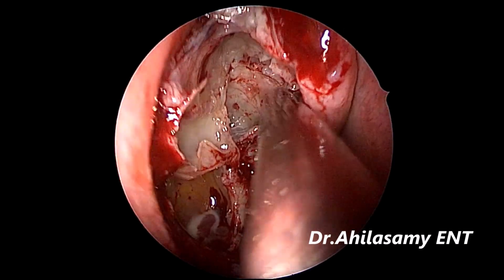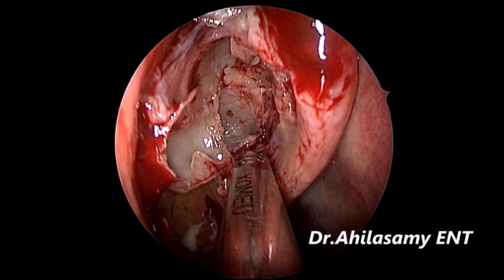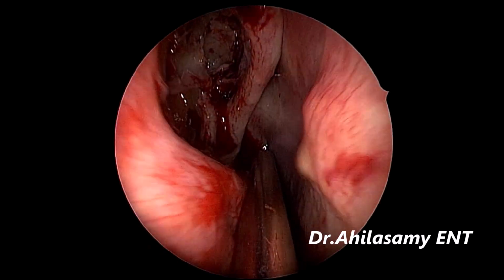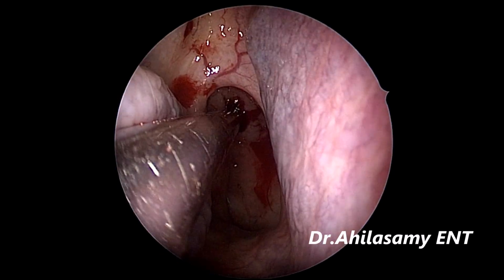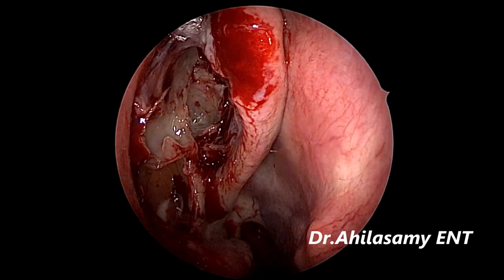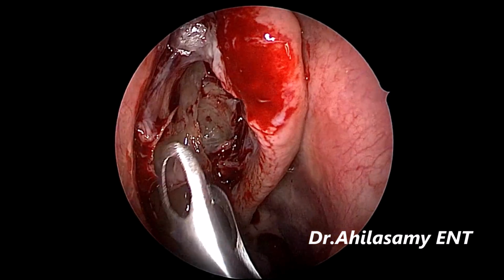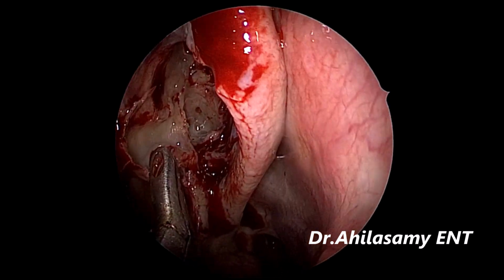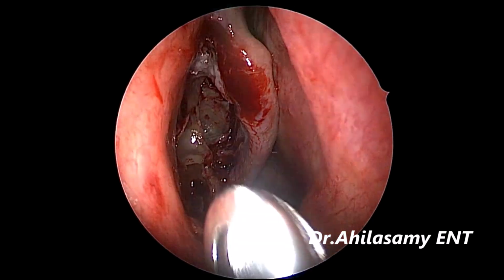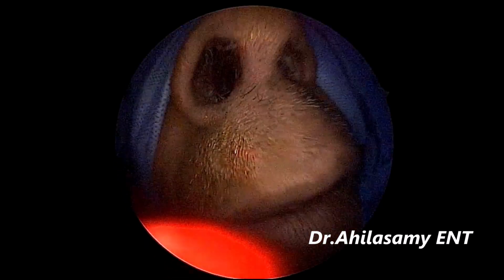Please appreciate the quality of field under local anesthesia without hypotensive anesthesia. Small bony chips have to be taken out. Constantly suck the nasopharynx or ask the patient to swallow. Don't leave behind any bony chips, otherwise granulations will form around it and post-operatively it will be a trouble.